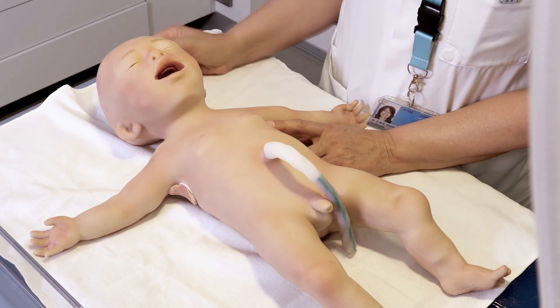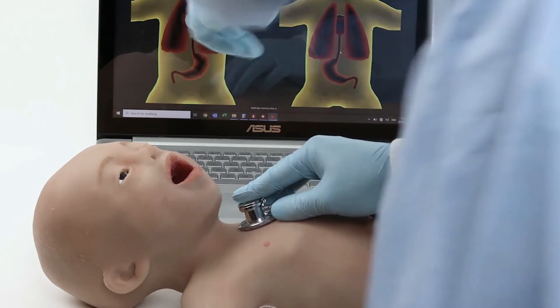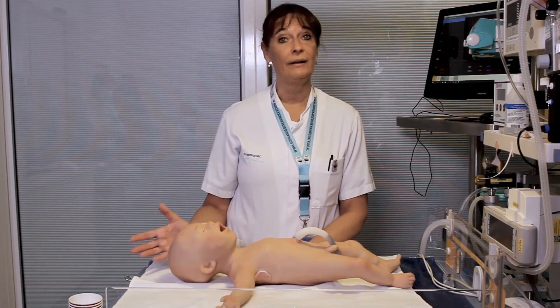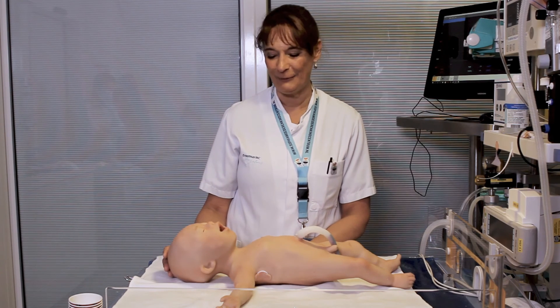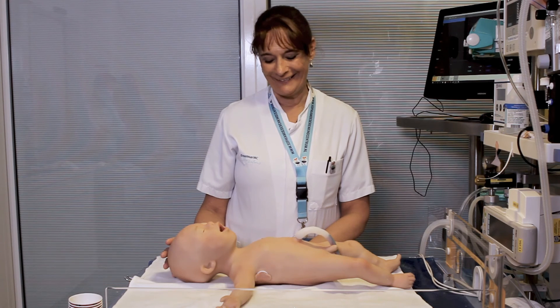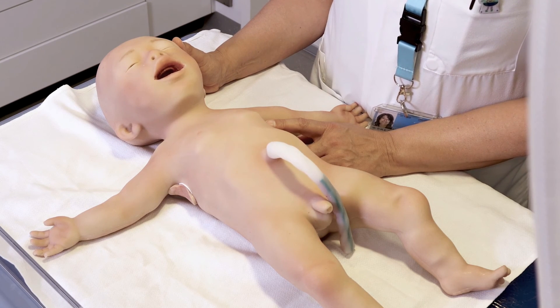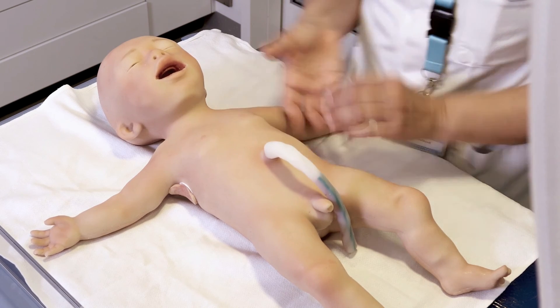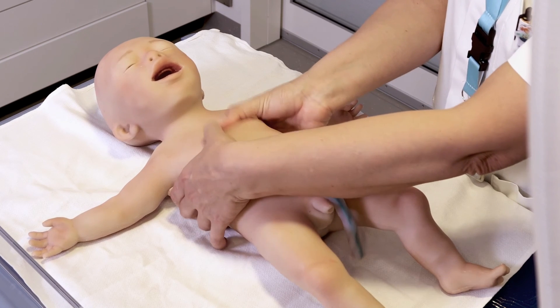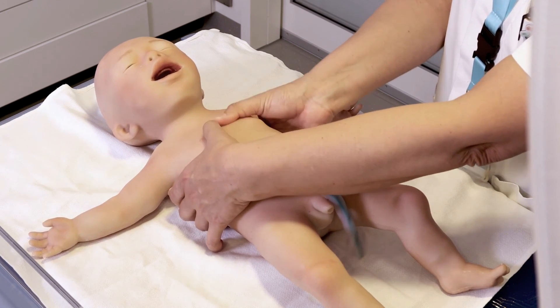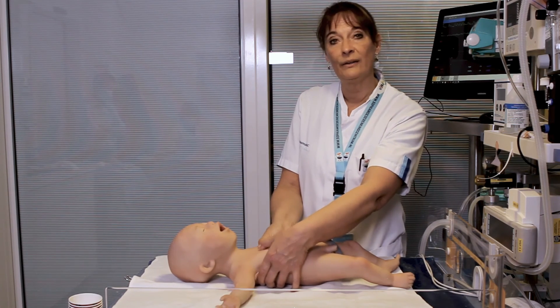You can import lung and cardiac sounds into the computer so that in a certain scenario you can listen with a stethoscope and play the sound. The baby can also cry and make sounds, but normally when a newborn is in distress they don't cry. You can also produce grunting sounds when a child is in respiratory distress. For CPR, compressing the thorax is very easy to do, and the tutor behind the monitor can see whether compressions are effective enough and whether the rhythm is good enough.